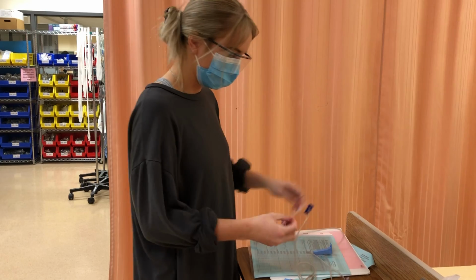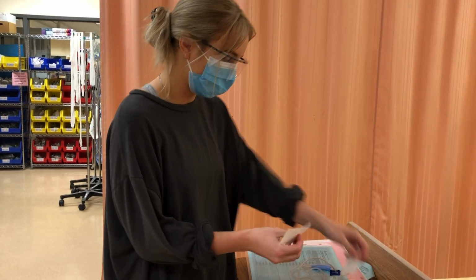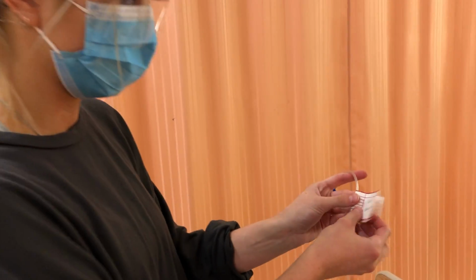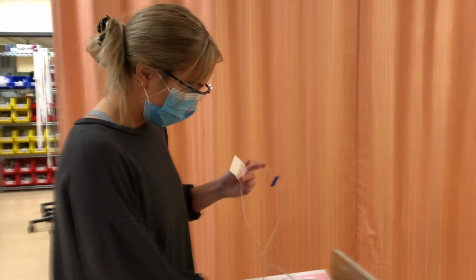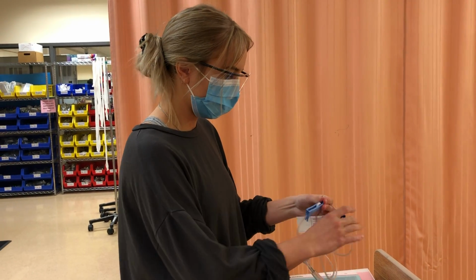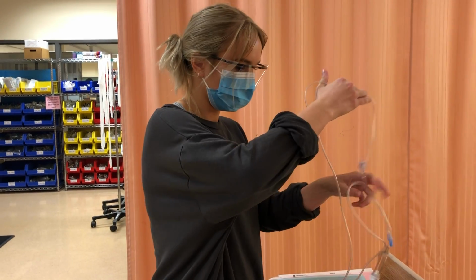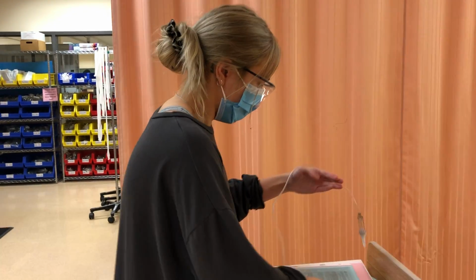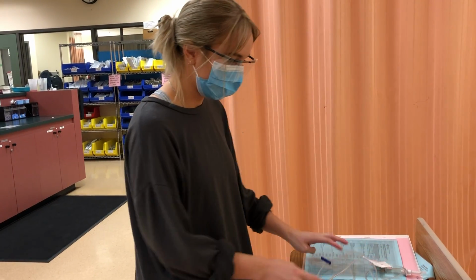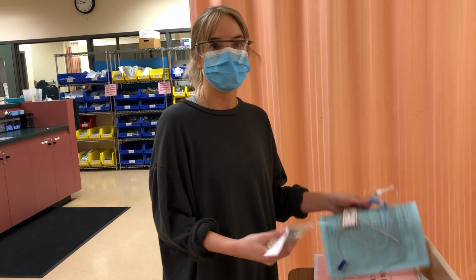So I'm just labeling the tubing with what it is, so insulin, and the time that it has been hung, so today and now. And just make sure everything's clamped off. Okay, so I will be going into the patient's room now.